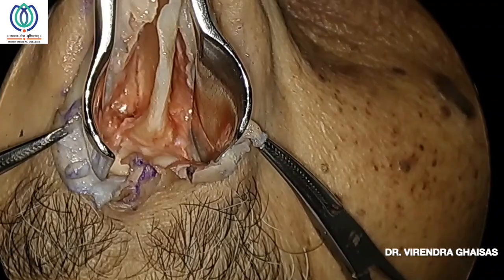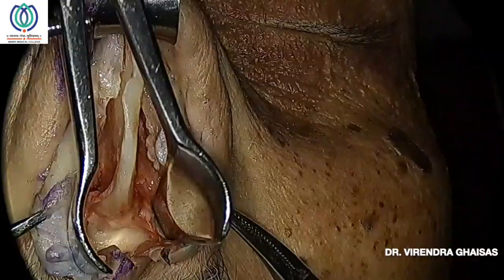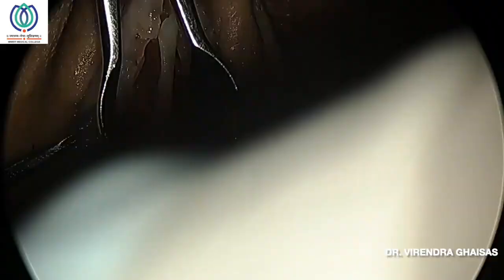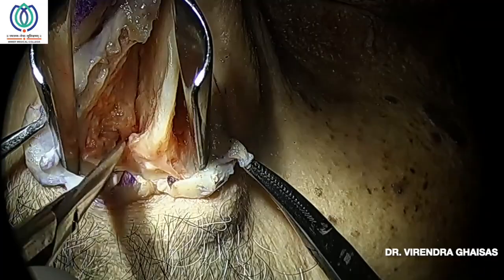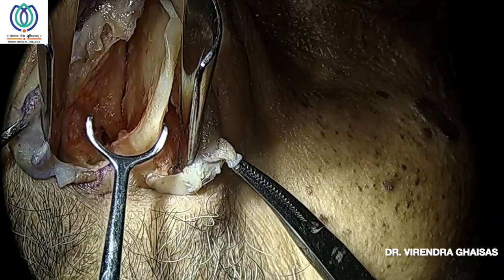Septoplasty is the surgery to correct the deviated part of the septum. The commonest is removal of the inferior strip and correcting the septal deviation, along with a small removal of the bony deviation. SMR is the surgery where we keep an L-shaped structure 1 cm intact and we remove the entire part of the bony and cartilages.